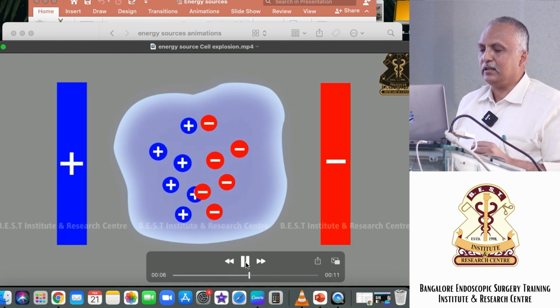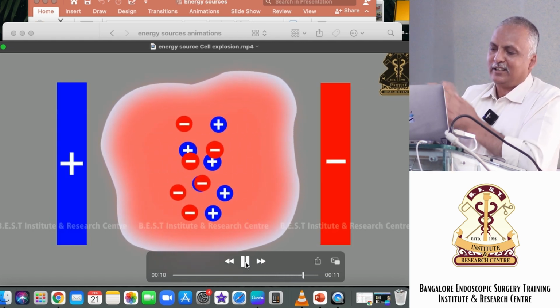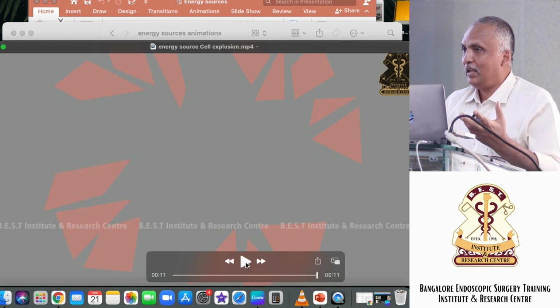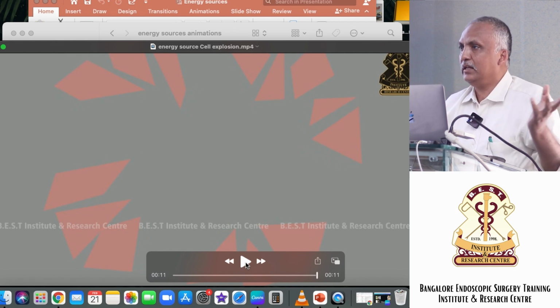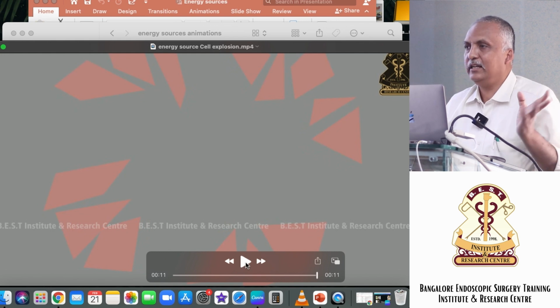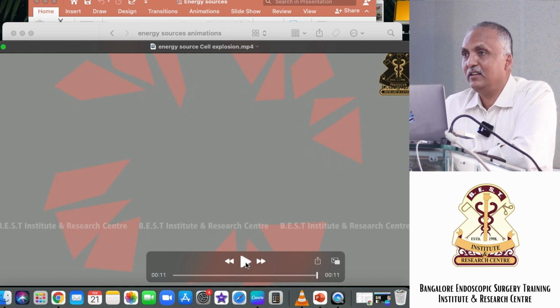They are beating each other, so it is getting hotter and hotter. And it burst. The water became steam so fast, it didn't have time to escape, and it just expanded the cell so much that the cell wall broke and it went away. So what has happened? The cell vaporized.